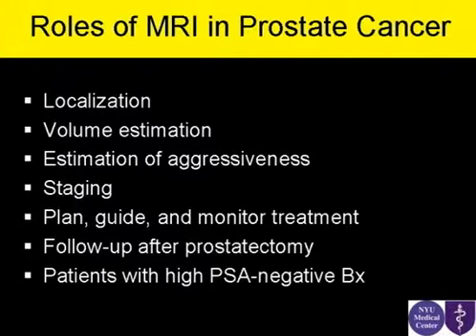In those cases, patients can also benefit from MRI because you can detect any recurrence in the prostatic bed. The other indication that appeared recently, and that we use pretty frequently in our department, is anxious patients with high PSA and multiple negative biopsies. I have almost 30 or 35 patients in my series now. One of the patients had like 10 biopsies, so I was wondering whether any prostate was left after that. But these patients and urologists get anxious about missing a small occult cancer, basically. And then these patients can also benefit from MRI and spectroscopy and other modalities.